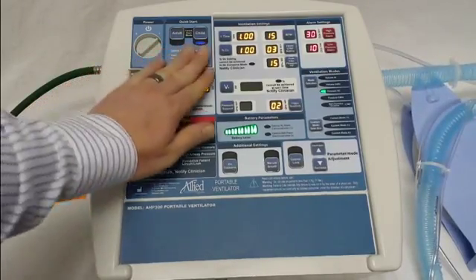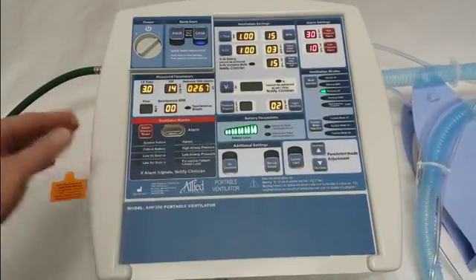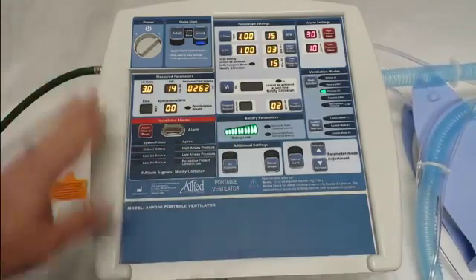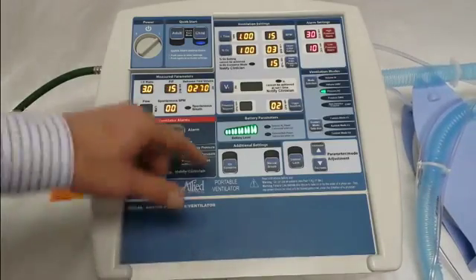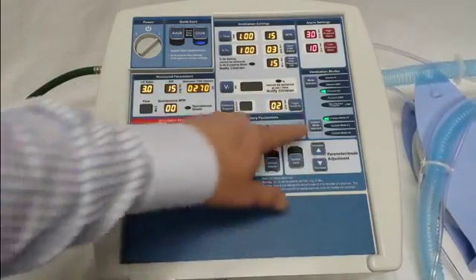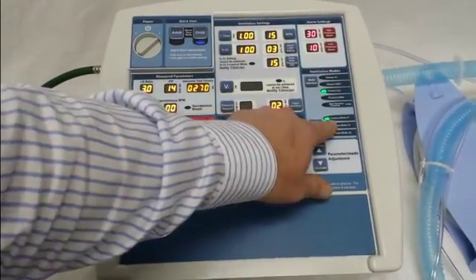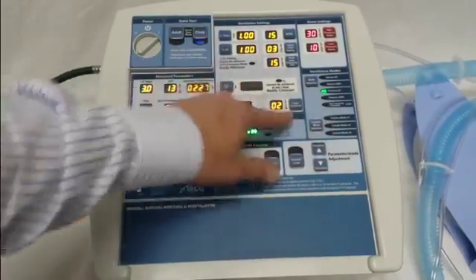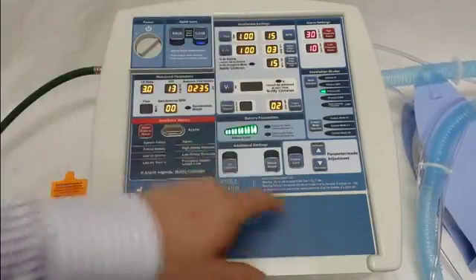That's setting the adult and child quick start. Now I'll move on to the custom modes. To set the custom modes it's largely the same process, but you're going to use different buttons. Again, they're locked out from the factory, so if I go down here and try to select it, it won't let me — you'll notice that it's flashing. It's still ventilating in child, and then after a period of time it just cancels out.